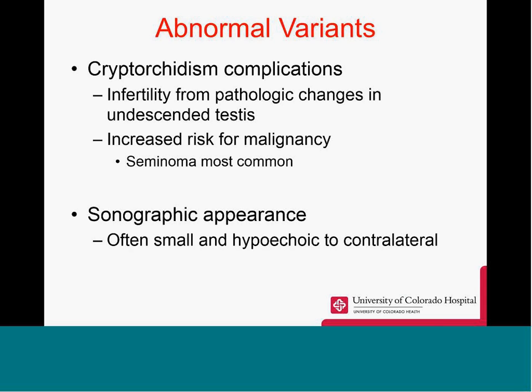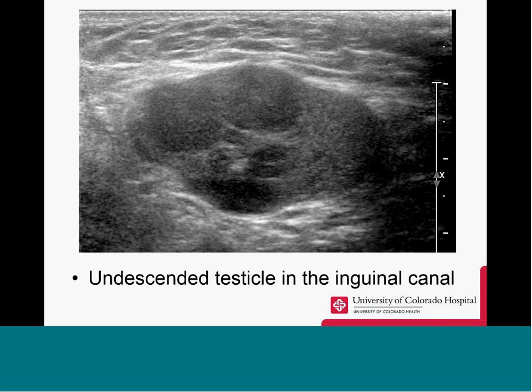Sonographic appearance: they are often small and hypoechoic compared to your contralateral, hopefully normally descended testicle. Here we can see an undescended testicle within the inguinal canal, with multiple hypoechoic masses within it. Not a good sign.